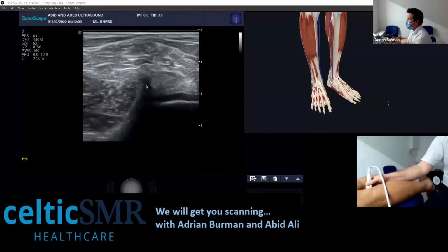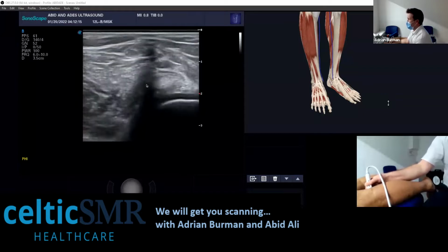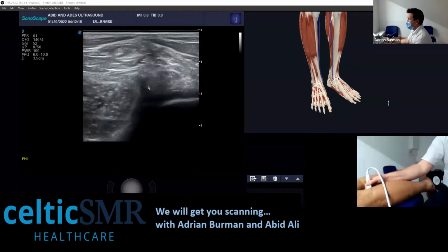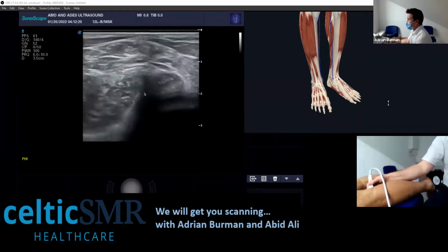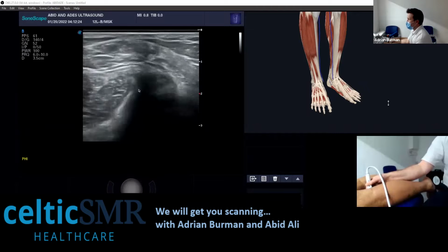And this is key to diagnosing your Baker's cyst. If you get a big cyst here, you have to see this. You have to see that to call it a Baker's cyst. If you don't see that, then it's a cyst, it's a sarcoma, or whatever. Always look for this speech bubble into this area, and that's your route back into the joint for your Baker's cyst.